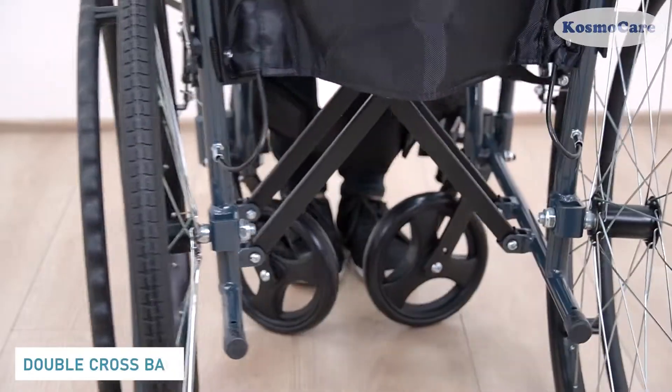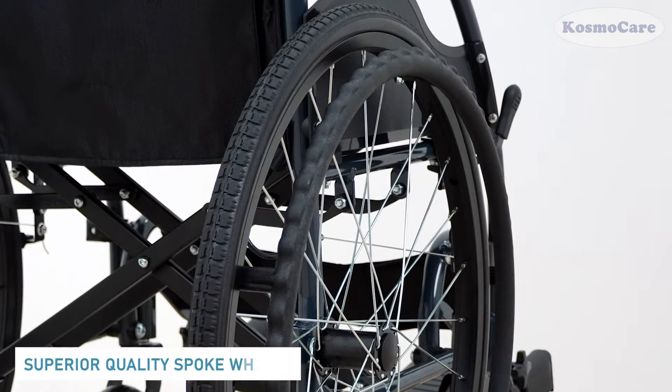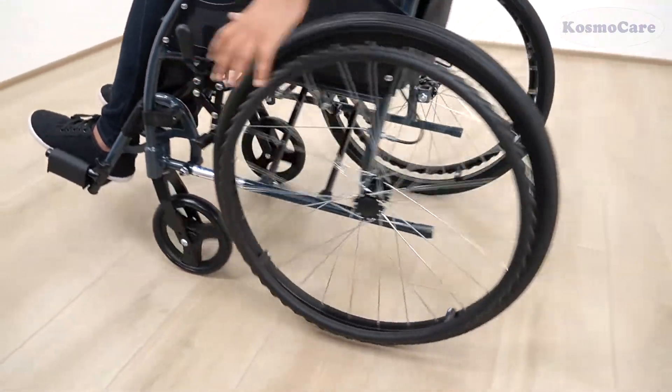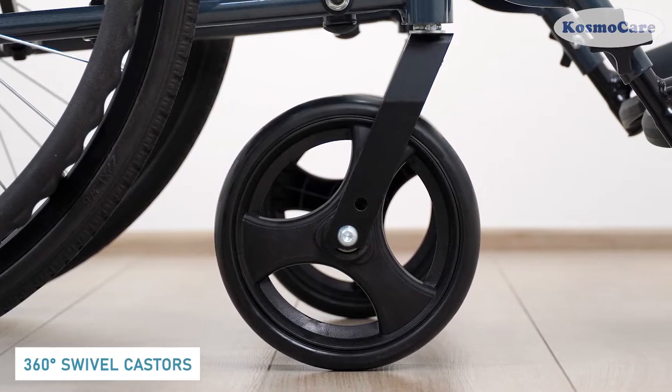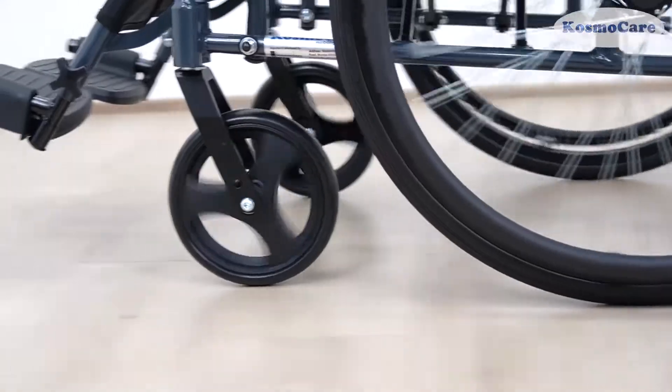The double cross bar adds extra strength to the wheelchair. The superior quality aluminum spoke wheels are low in maintenance, with no air filling required. The solid PVC front casters swivel 360 degrees to maneuver the wheelchair through tight spaces.